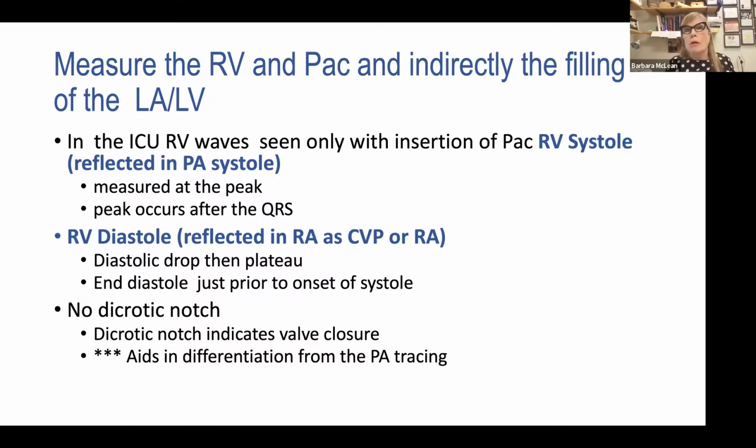So they've just gotten out of med school, and their attending says, you go with the fellow, you're going to float a PA catheter. They don't know what it is. They're not really too sure about it. They're watching a YouTube video, and that is not to demean anybody. We just don't do it enough that we have experts. And that's really, really important.